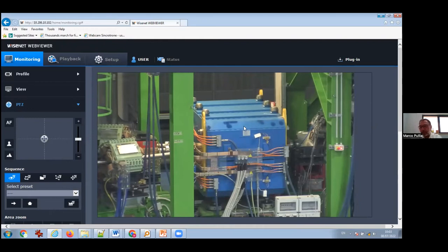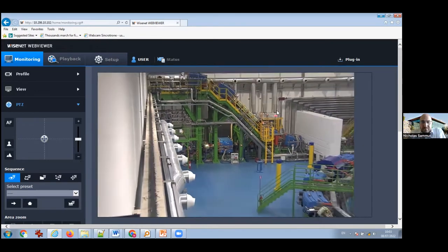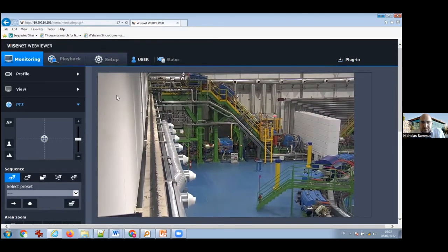Depending on the polarity of this magnet, the beam is deflected to the left into treatment room number 1, to the right into treatment room number 3, or when it is off, it goes straight into treatment room number 2, which is the one where we have also the vertical beam line that you see going up and then going against this wall. On the left of this wall, there are the treatment rooms.